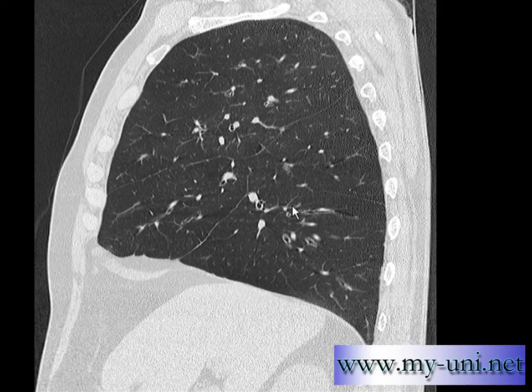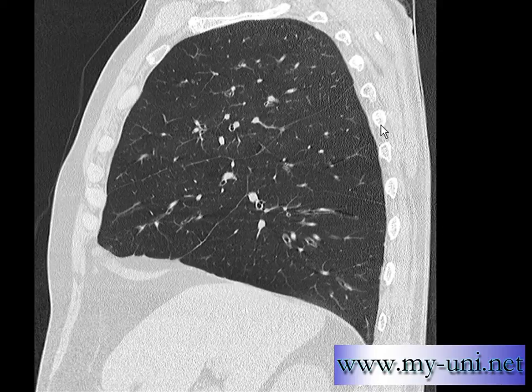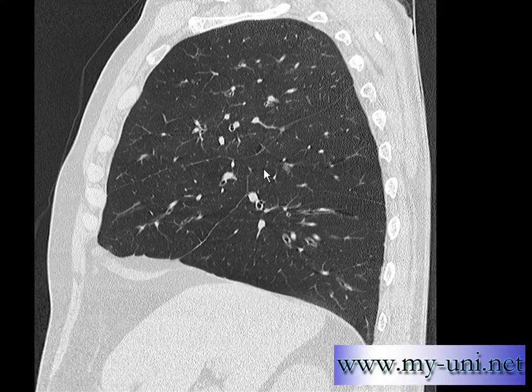This is a set of images reconstructed as sagittal images. They are equivalent to a lateral view. The difference is they are in slices, and for that reason they have much better definition for the anatomy and for any pathology. This is the anterior side of the patient, this is the posterior side, these are ribs, this is the superior aspect, this is the inferior aspect, and this is the diaphragm.